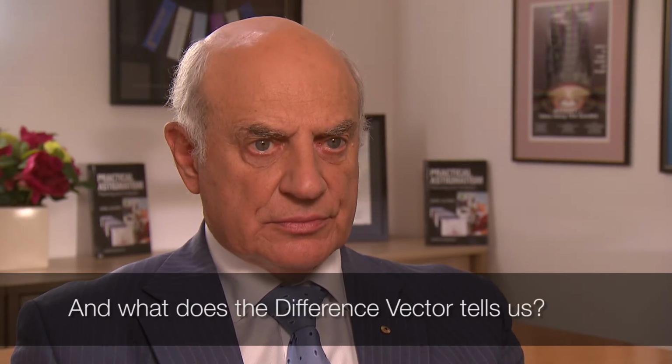So you will find the two analyses are parallel but a little bit different, and often the answer lies somewhere in between the two. And what does the difference vector tell us? So the difference vector is the third vector. The difference vector is what is left over in the astigmatism, what you have missed your target by. The difference vector is a very objective means of measuring how much astigmatism is left over in absolute terms.